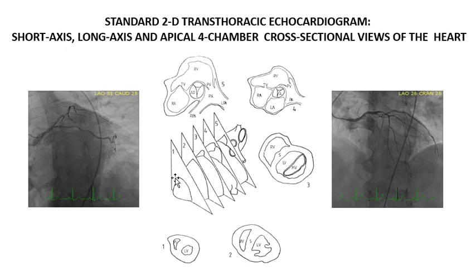Relating your echo cross sections to our coronary anatomy, you'll see they're totally unrelated. Again, this is one of the standard cross-sectional views in your echo studies, the short axis. In other slides, you'll see the rest. I included them all in the heading, but you can see the cross-sections through the heart and what they look like in your ultrasound images, as opposed to our coronary artery images in this case, and how we have to visualize the entire structure selectively with injections, and you visualize sections of the cardiac structures selectively at different angles of cross-section.